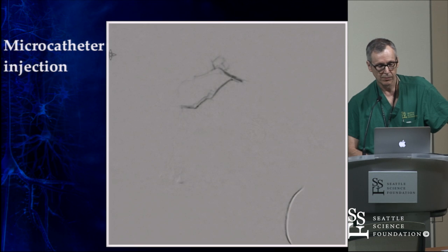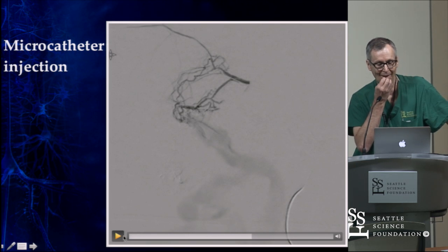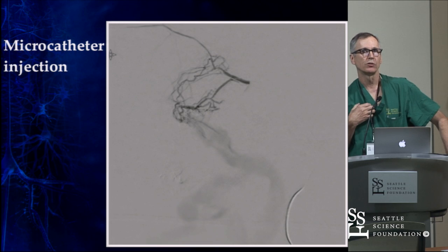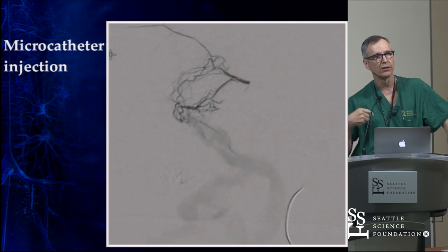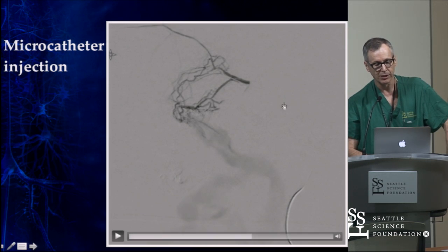I thought with the pressure thing, he did something with that Copernicus balloon. Or does he put that in the sinus as well? The Copernicus was to protect the sinus itself, and then to embolize that. But the pressure cooker is actually sort of sealing the artery and having the second catheter more distal, so there's no reflux. And so this is with that middle meningeal sealed.